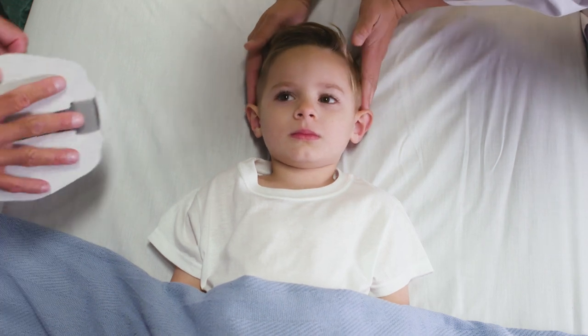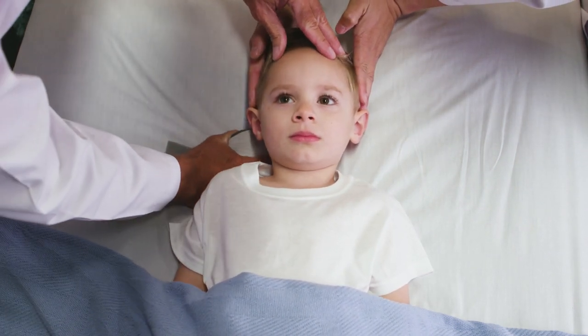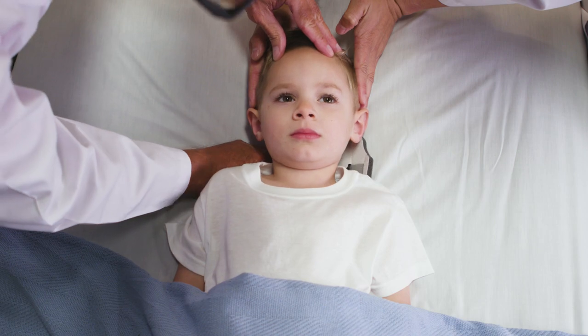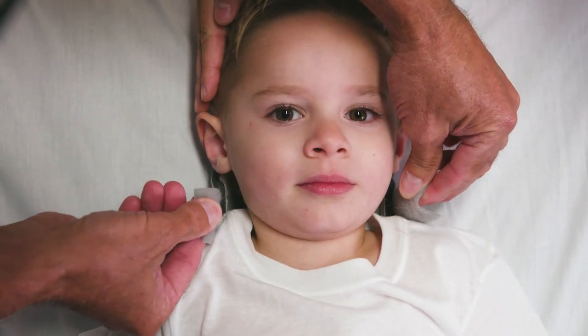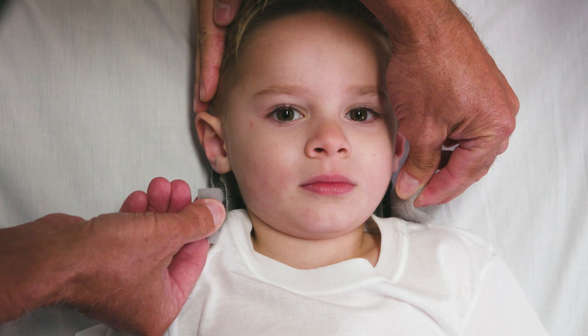Gently slide the back panel underneath the patient's neck while the head is held in neutral alignment. Ensure the back panel is centered by bringing the hook and loop straps upward and confirming that they are of equal length on each side.